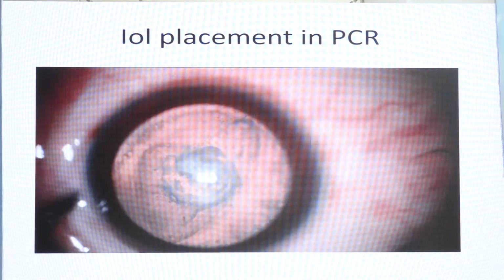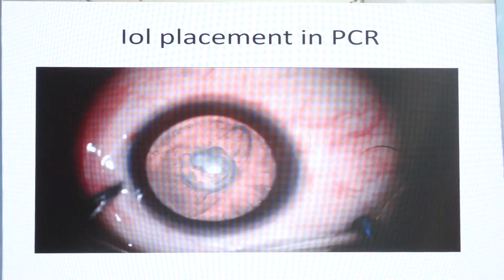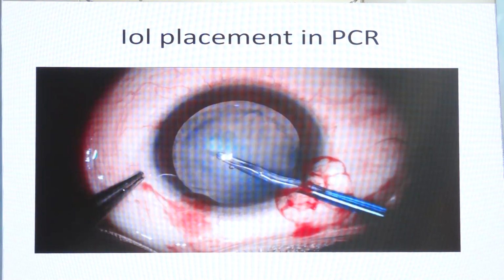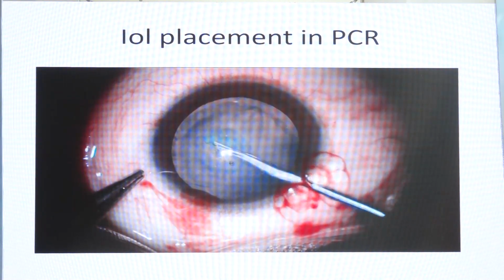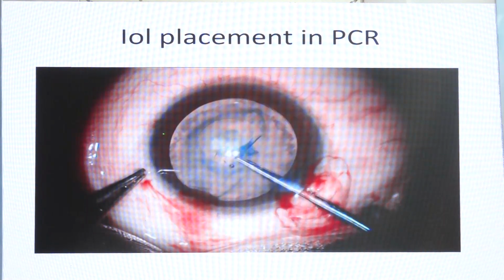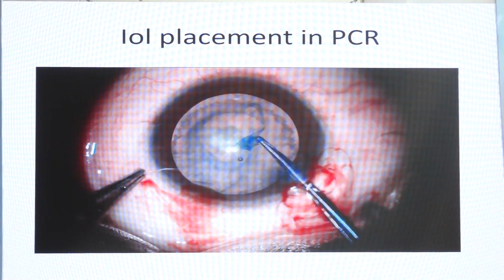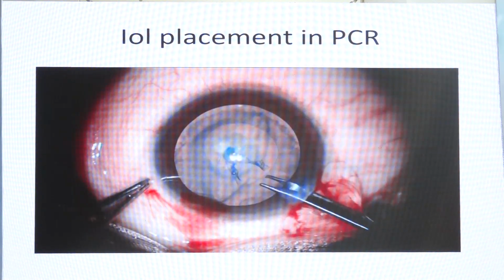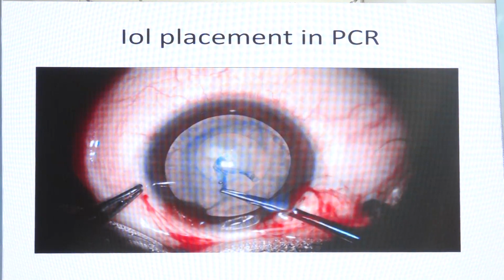This is one video where I assessed preoperatively that there was a large rent we tried to evaluate. Use the rhexis of relatively good size, but keeping in mind that you may have to put the lens in the sulcus, so it should be good.